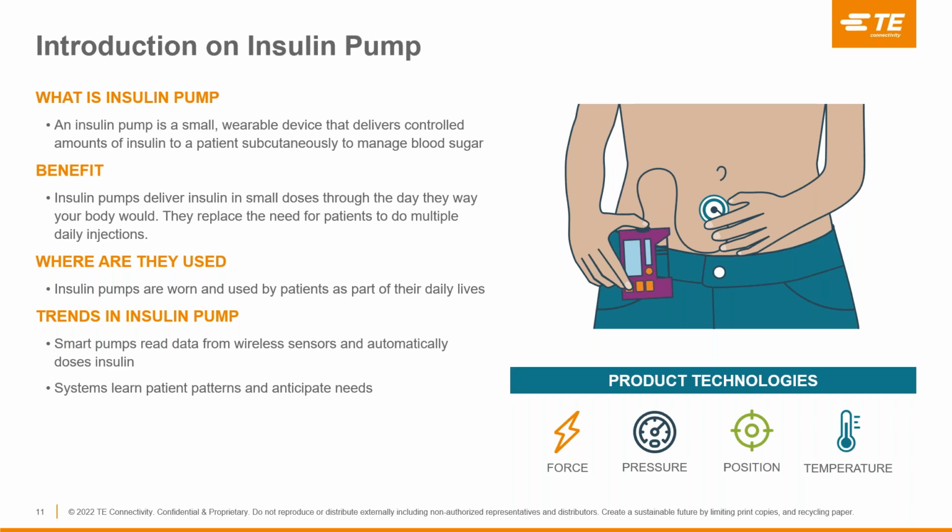Being used as part of your daily life subjects them to all kinds of things that you wouldn't get exposed to in a hospital environment. So they're going to see things like heat, humidity, cold. They're going to experience bumps and falls and many other conditions throughout the day.